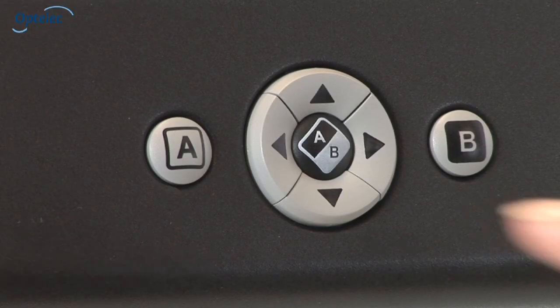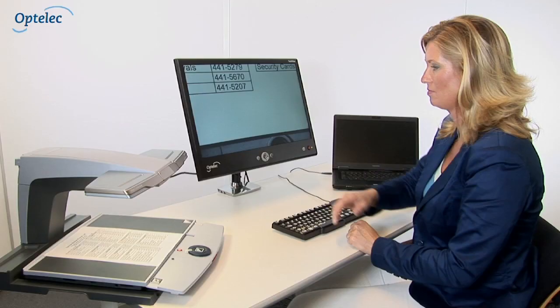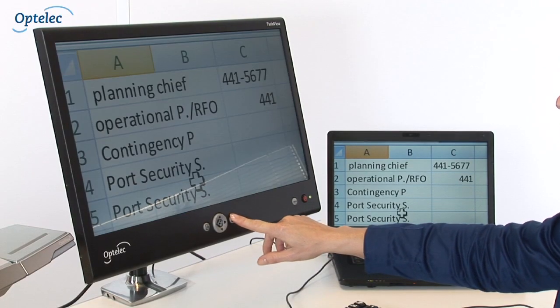The high contrast buttons make switching between the computer and the video magnifier image extremely easy. Press the A button to view the image from your video magnifier. Press the B button to view the image from the computer.